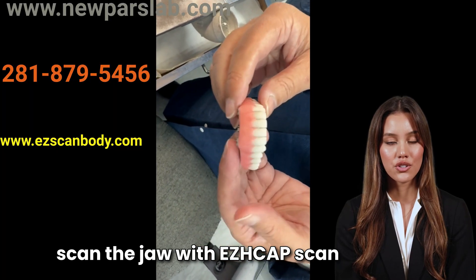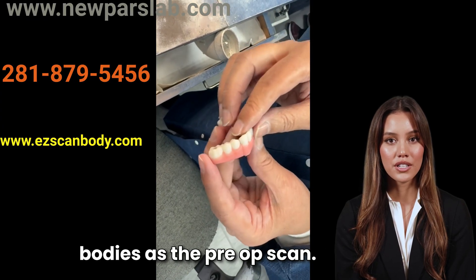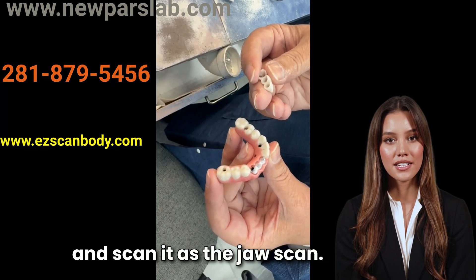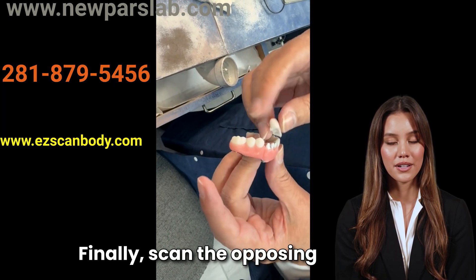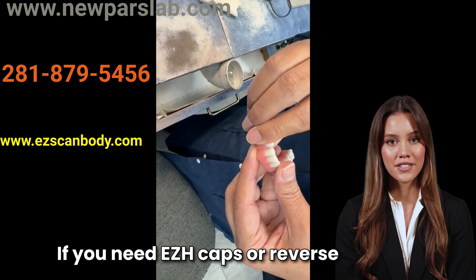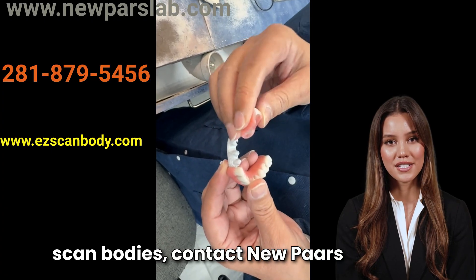Briefly, scan the jaw with EZHCAP scan bodies as the pre-op scan. Then place the denture back and scan it as the jaw scan. Finally, scan the opposing arch and the bite. If you need EZHCAPs or reverse scan bodies, contact New Pars Dental Lab.